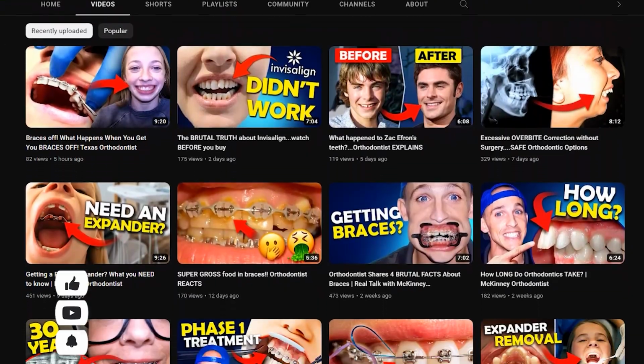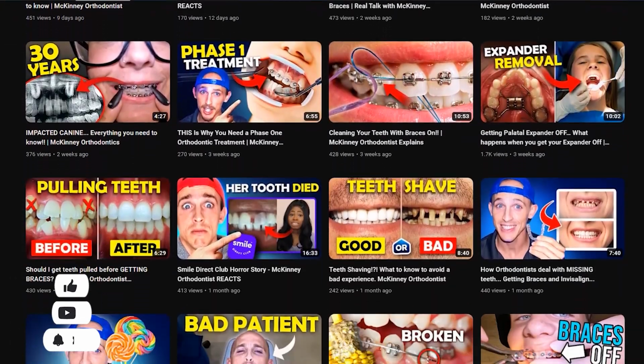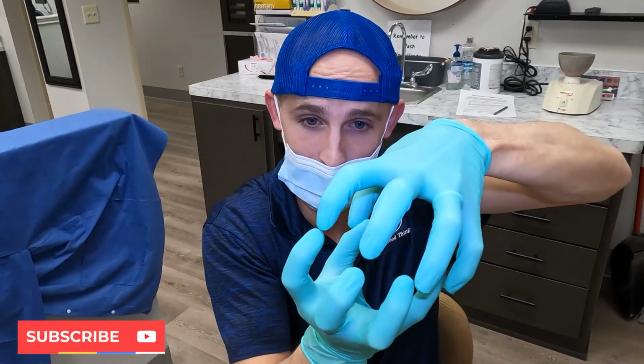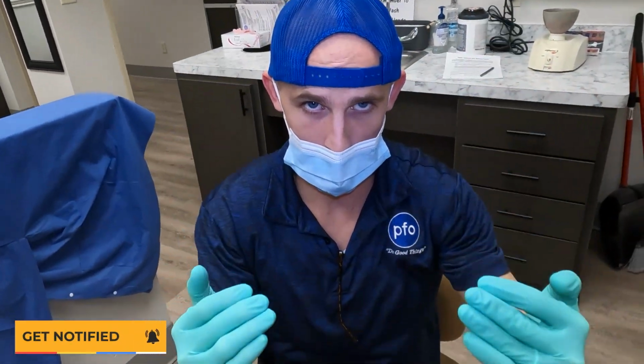If you want to learn about expanders going into your mouth or getting taken out of your mouth, we have other videos you can check out, but we wanted to show you, and Brooklyn has agreed to let us see her mouth. One of the reasons why we would consider using an expander is because, like I said, when our bite comes together, sometimes our top jaw is maybe a little narrow, or the teeth are a little narrow, and our jaws come together and we don't like it, so we shift over. So come down here, let's look at Brooklyn.